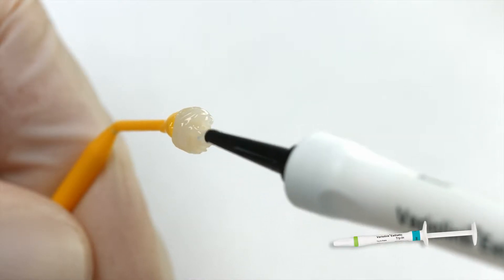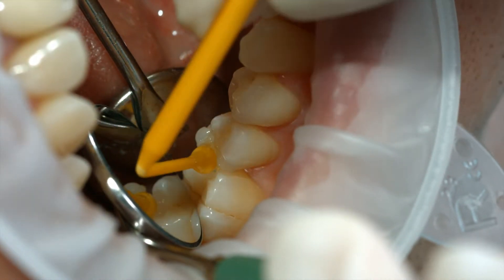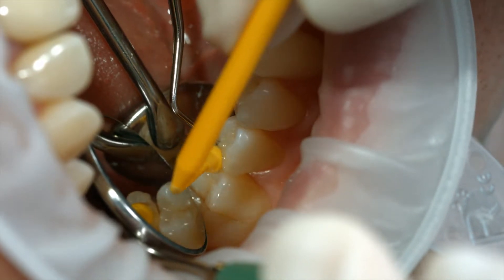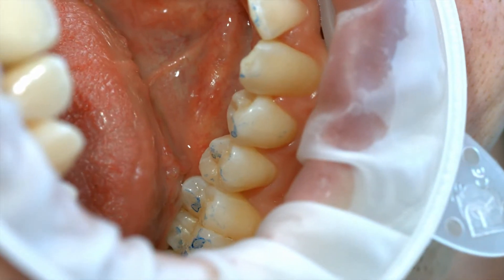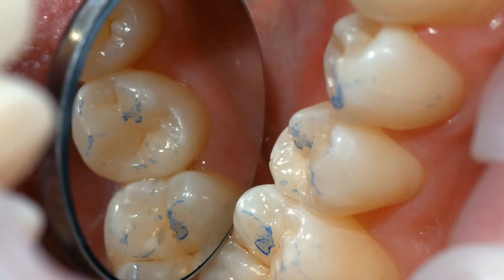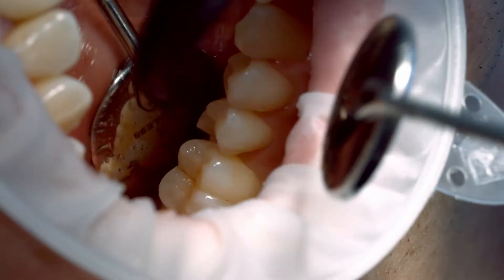For optimum aesthetic results, use Variolink Aesthetic Try-In Paste to evaluate the shade of the restoration. When trying in the permanent restoration, check the shade effect, accuracy of fit, and occlusion of the restoration. Thoroughly rinse off the Try-In paste with water spray after the Try-In and dry the preparation with water and oil-free air.